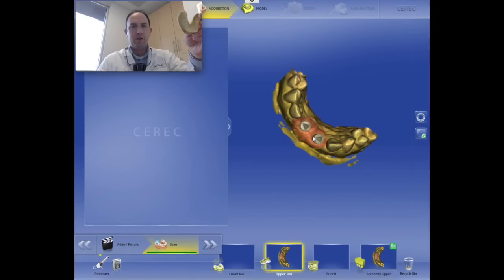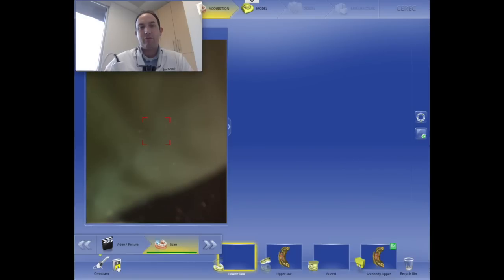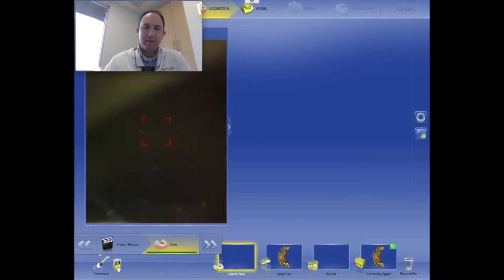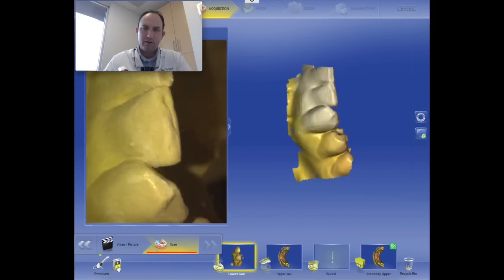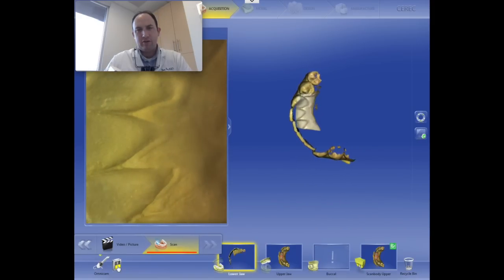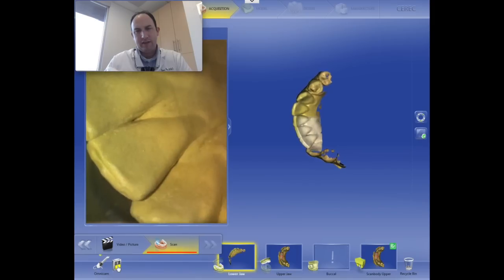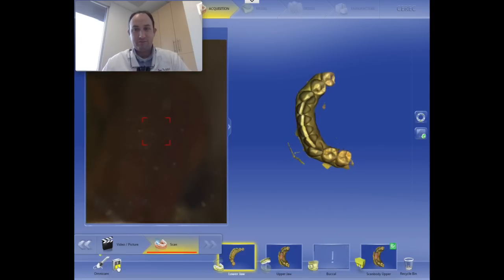Okay, so here's our lower arch. And again, the only reason I did it using this technique is we didn't have the tibases in the office, and so we had to take impressions. We had used him on a previous patient. So I'm going to go ahead and scan the lower arch, and I'm only going to scan what I need. I'm not going to scan the entire lower arch. And I think most of you will agree with me, but when you scan a stone model, it tends to scan a lot easier than teeth, probably because it's dry and there's not as much saliva and all that stuff, right? So that's plenty. We got a little bit of extraneous imaging there.